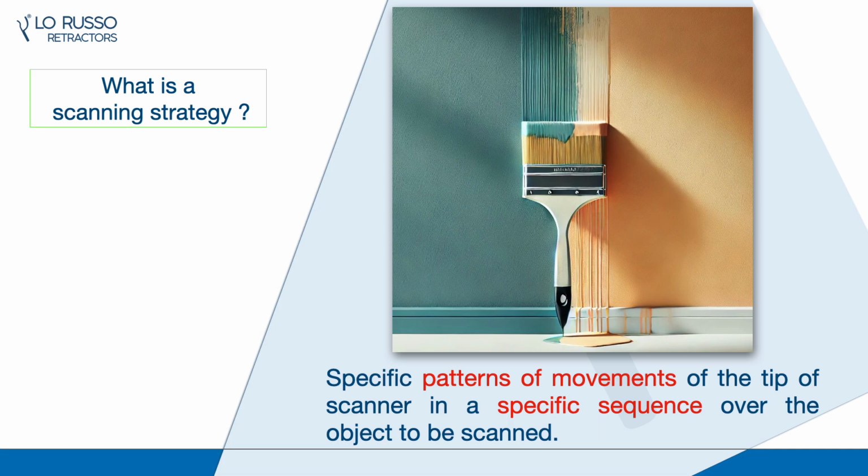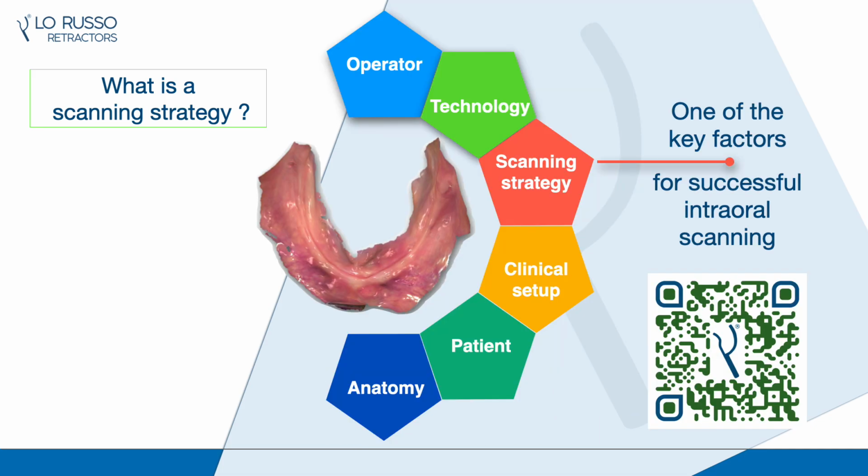However, for the high-profile clinician, this definition is insufficient. It describes the what, but fails to capture the why of the biomechanical process. A specialized strategy is the enabler of accuracy. In edentulous patients where traditional landmarks are absent, the strategy is what makes direct digitization possible. Following the validation of Lo Russo et al., 2020, we know that adhering to a specific protocol is what allows us to reach a micrometric accuracy level of 20 to 30 microns.